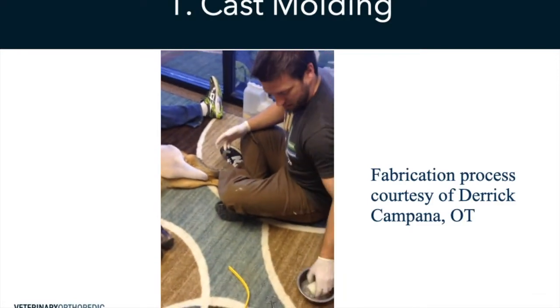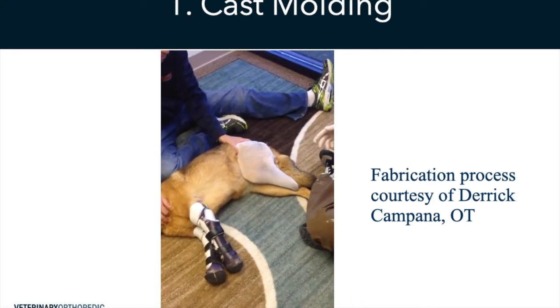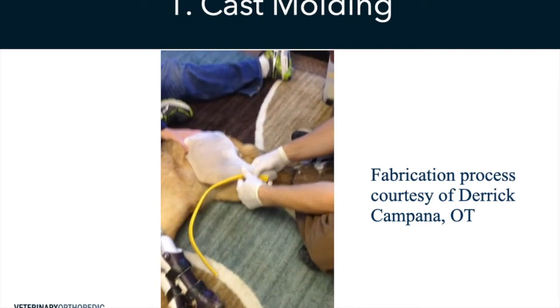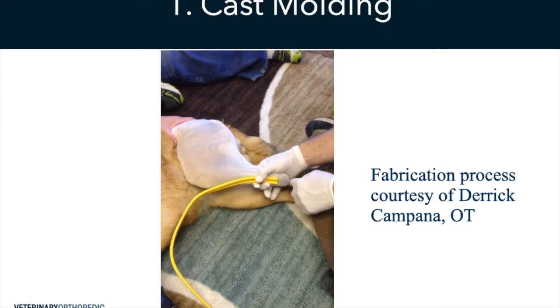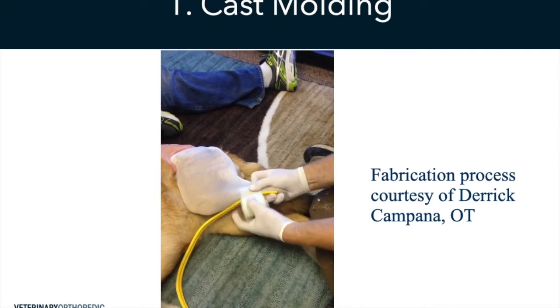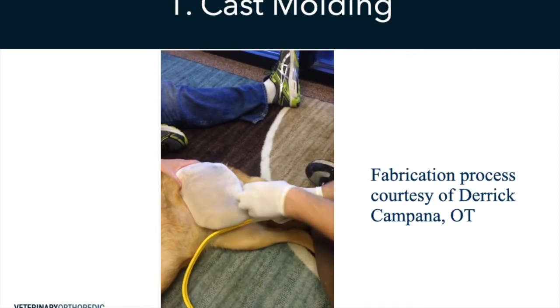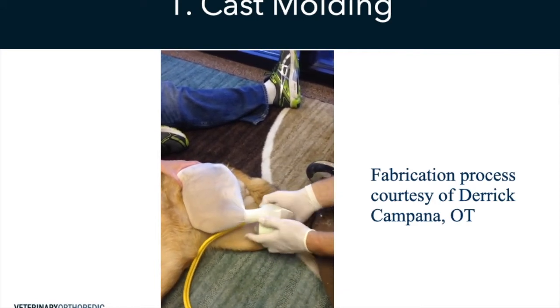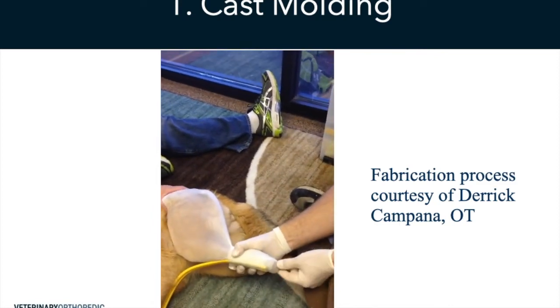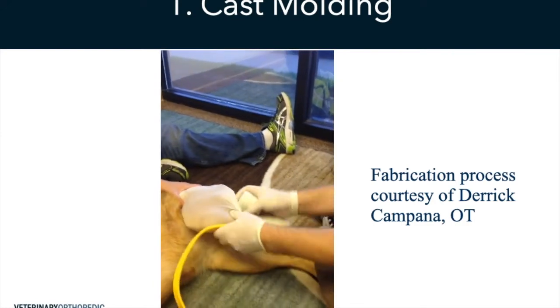So the fabrication process. First thing we're going to do is take a soft cast material. This is a 3M material. Just so you can see the stump. And I'm not bringing the cut strip to the end so we have a good picture of the distal edge of the stump. It's also important to flex the hock to help distribute the pressure from the end of the stump to the back. That usually helps with pressure distribution and sores.